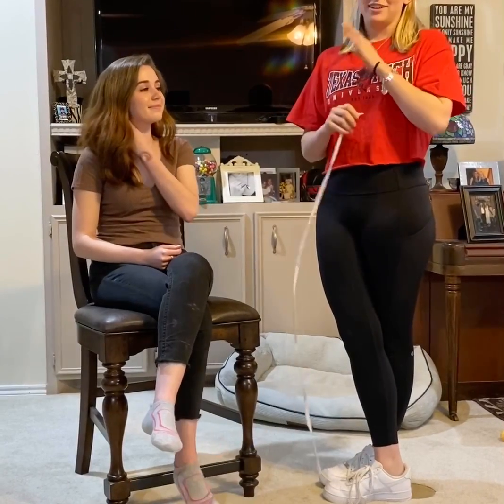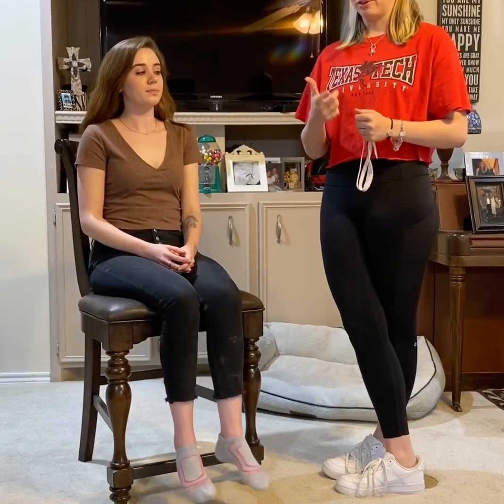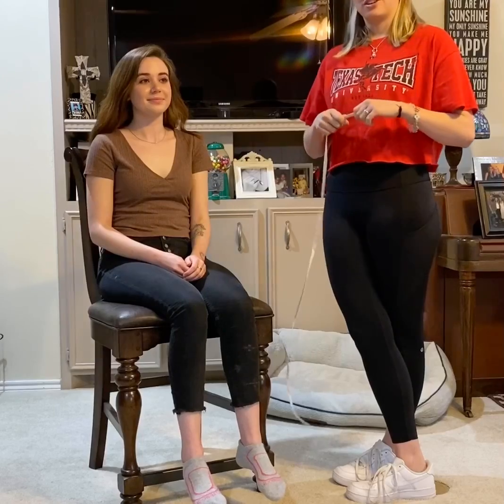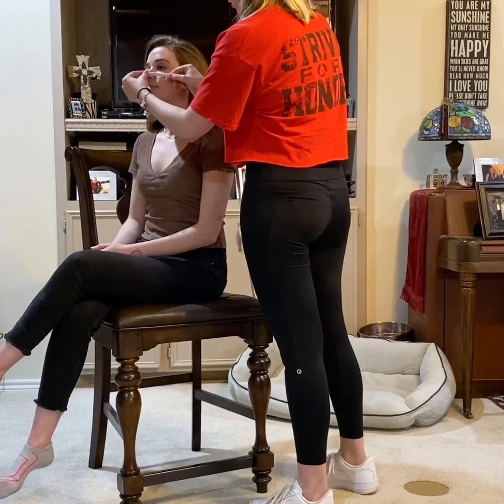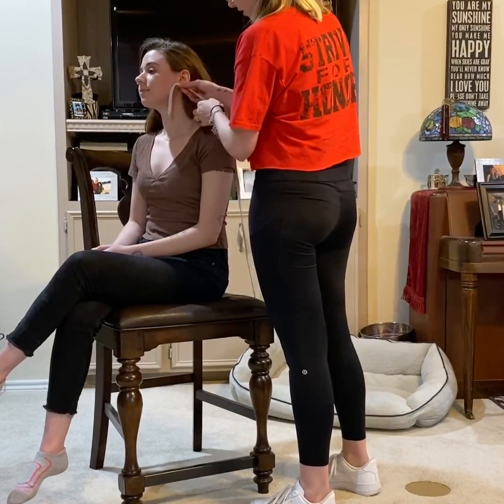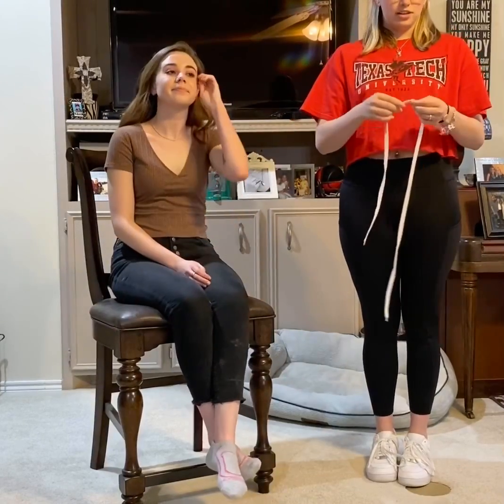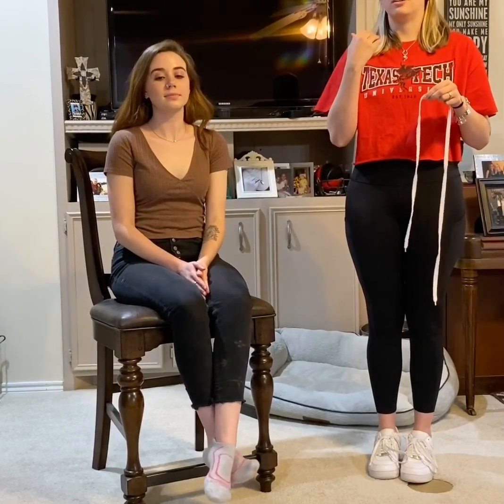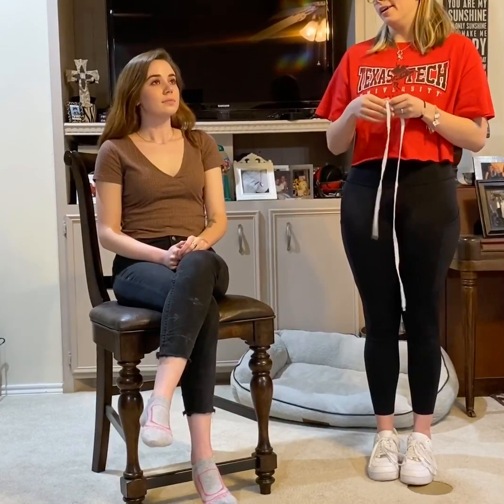Before you even insert it, you'd gather your supplies — your nasogastric tube, a flush so you can check the aspirate, and some lube for the end. To get started, you measure from the tip of the nose to the pinna and also down to the xiphoid process. You'd mark it so you can get an accurate depiction of where your nasogastric tube is and whether it's displaced or hasn't gone in far enough.